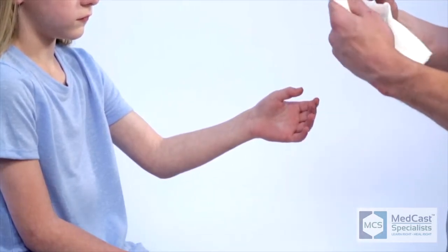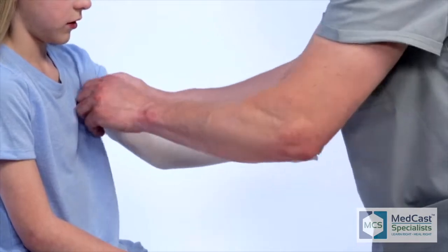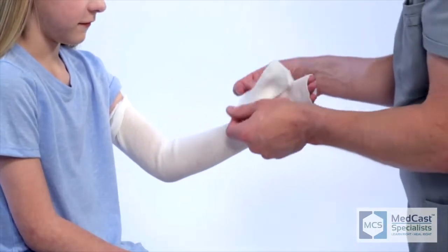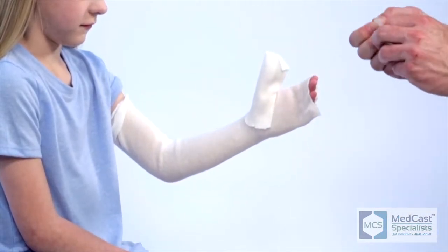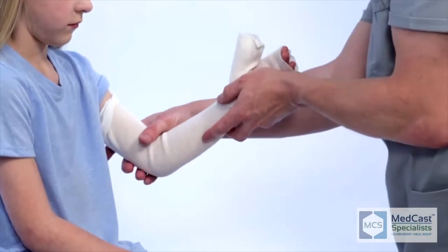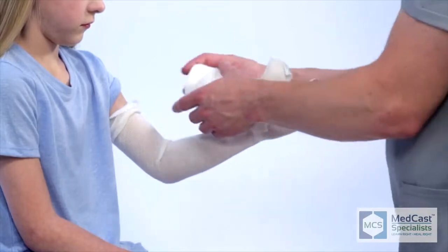One tough thing to remember is they're going to have an acute injury. As you're applying your stockinette, we like to bunch it up and then slide it right up the arm. In that sliding technique, you stretch the stockinette at the same time so you can slide it up without moving the arm around a lot — it just seems to glide up really easily. It's also nice to tape your thumb stockinette down so it won't pull up later during or after application, especially with younger kids who tend to pull at those.